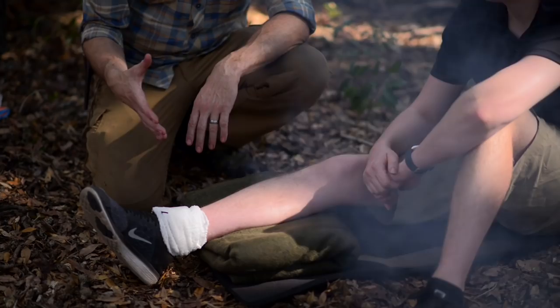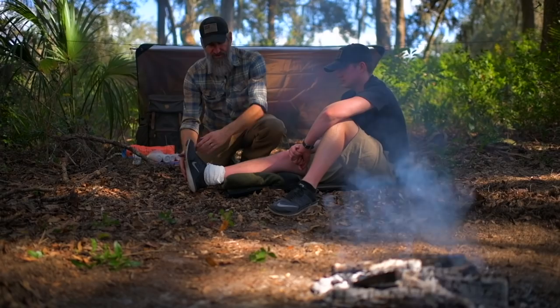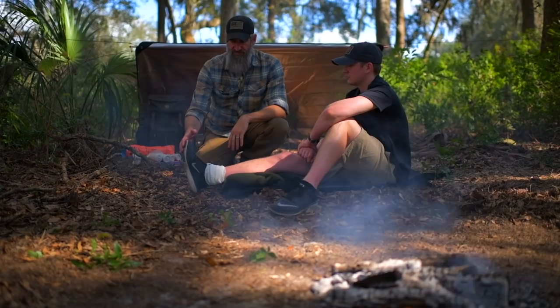The second principle is to splint in a position of function, or at least a position of comfort. The position of function for the hand would be a kind of a kung-fu grip. For the ankle it would be a 90-degree angle, and for the knee it's kind of relaxed at that natural resting point. If there is no position of function, then at least a position of comfort — whatever is most comfortable to the person you're working on. And keep in mind these principles apply to working on yourself as well.